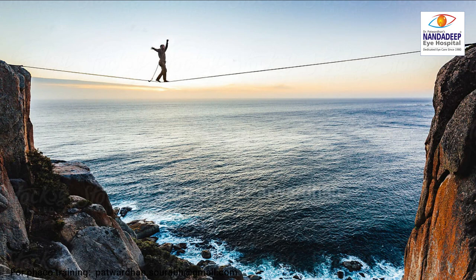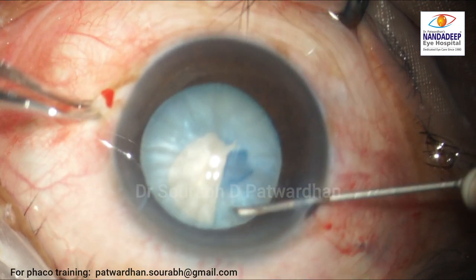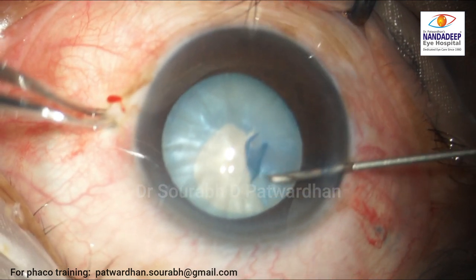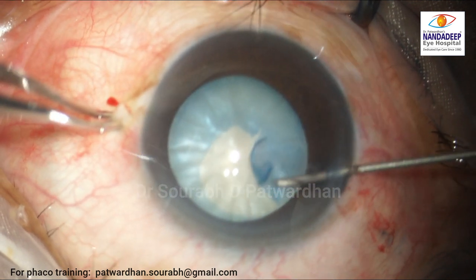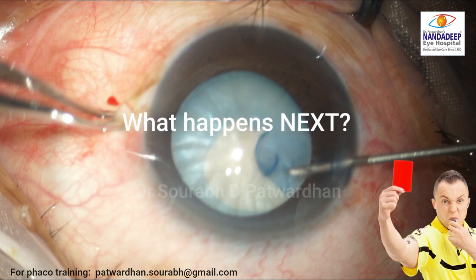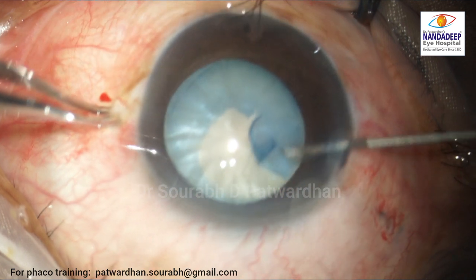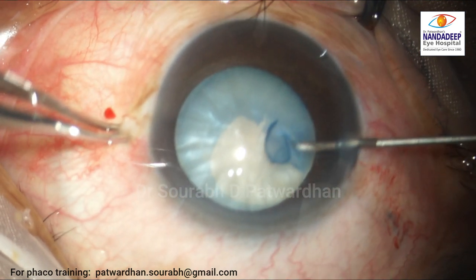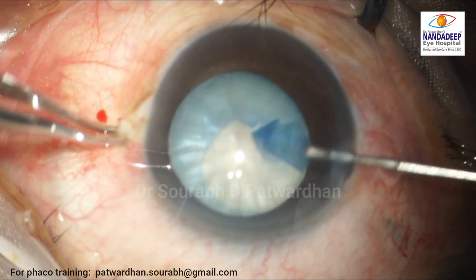The surgeon is walking a tightrope here because the rhexis margin is already in the area of the zonules. We are at the mercy of these anatomical structures — how the zonules are pulling this margin away, how the intumescence is in this area, whether there are any fluid pockets. Fortunately, the surgeon could bring the rhexis back here.